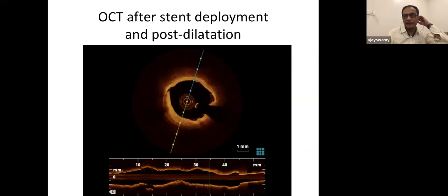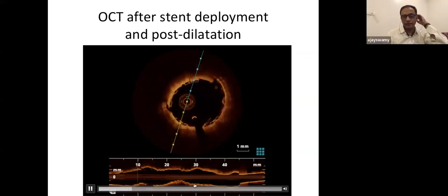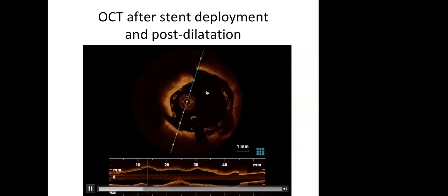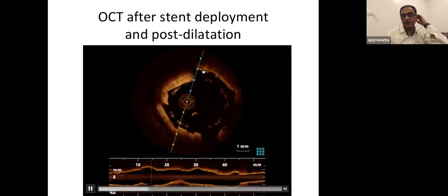Should I play it again? No, sir. Maybe just the part which shows the perforation, sir. If you can pause it. So there, you can see this. I'll see if I can pause it. Here, you can see that's this break. Yeah. You can see this break here. I don't know if you can appreciate. I'll just show it again. You can see this break here.